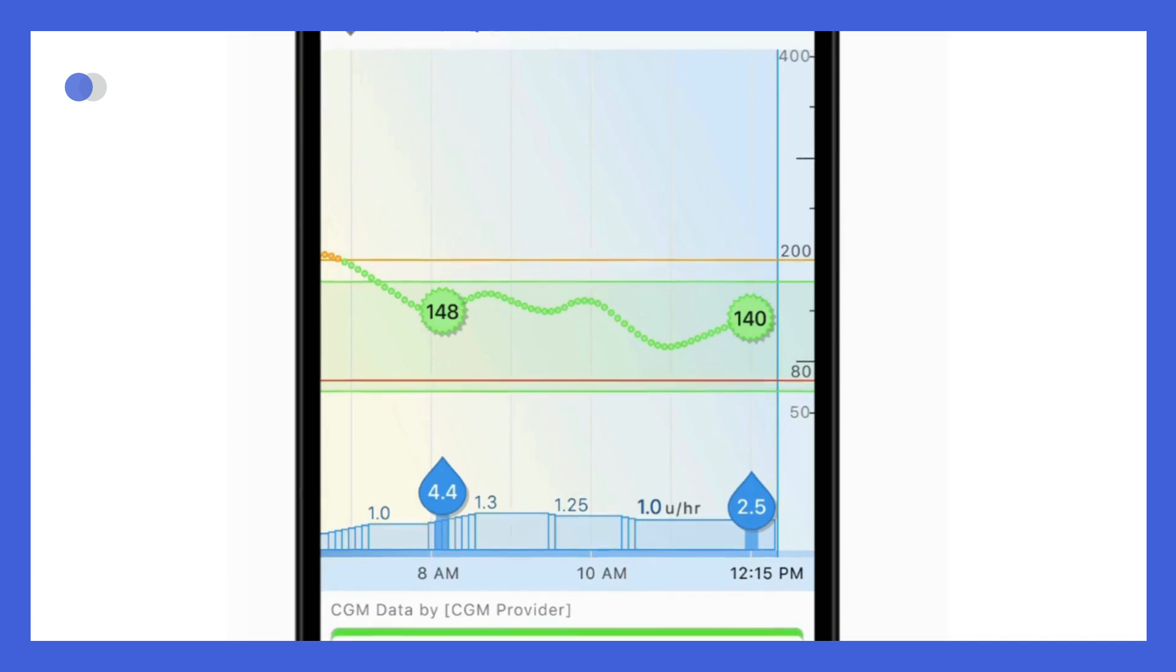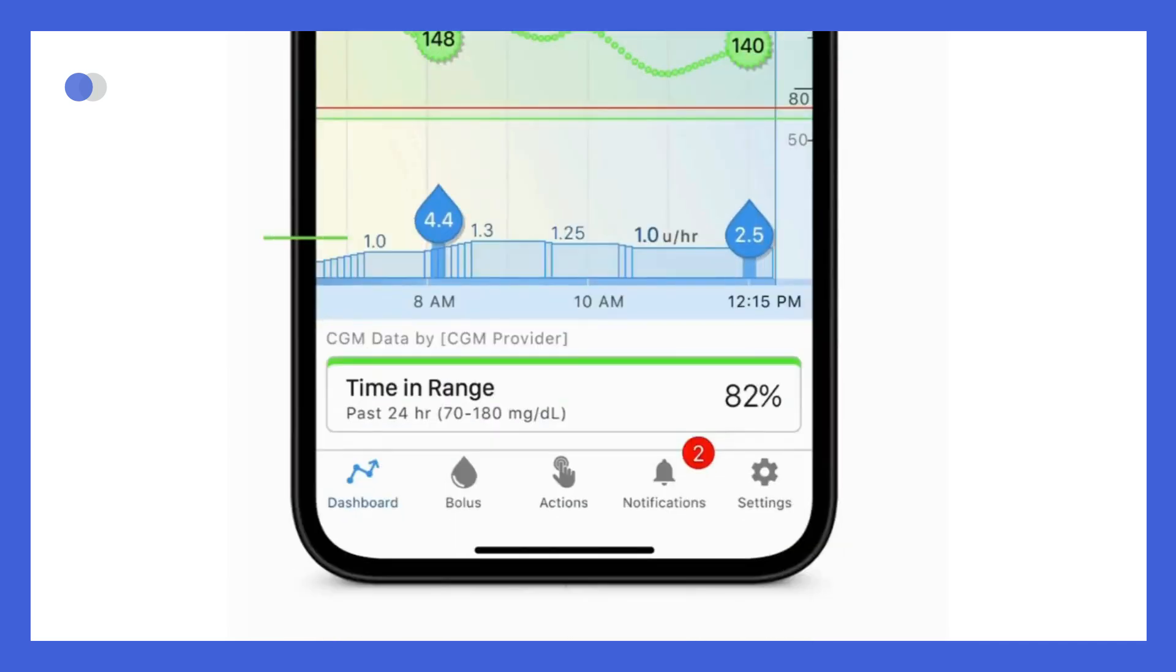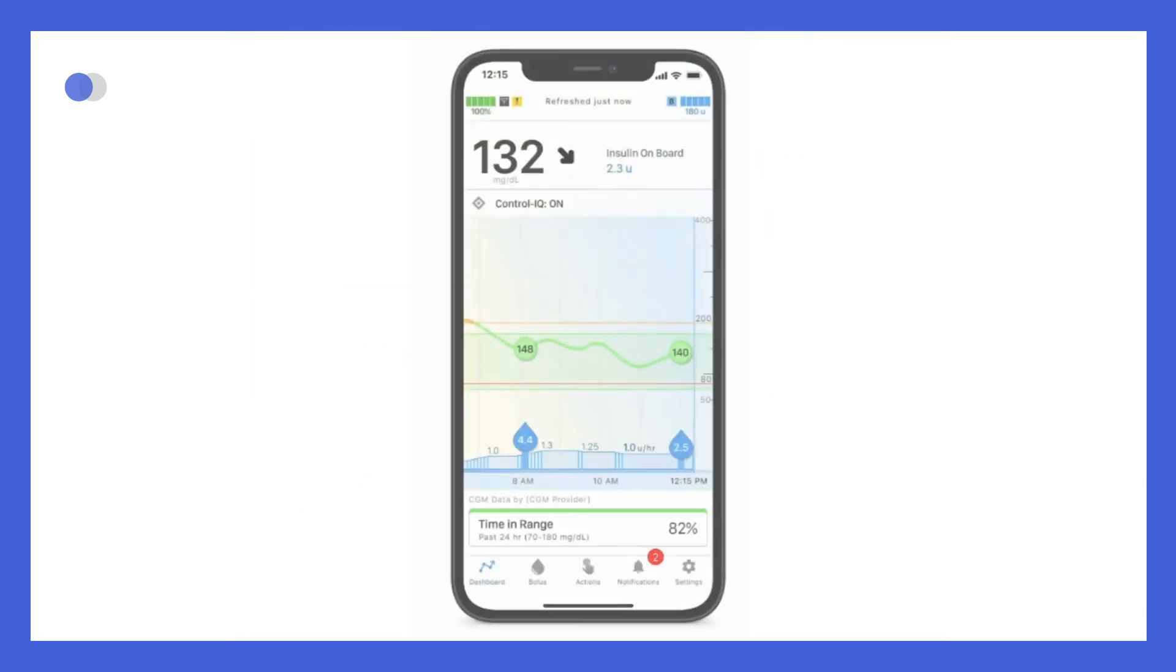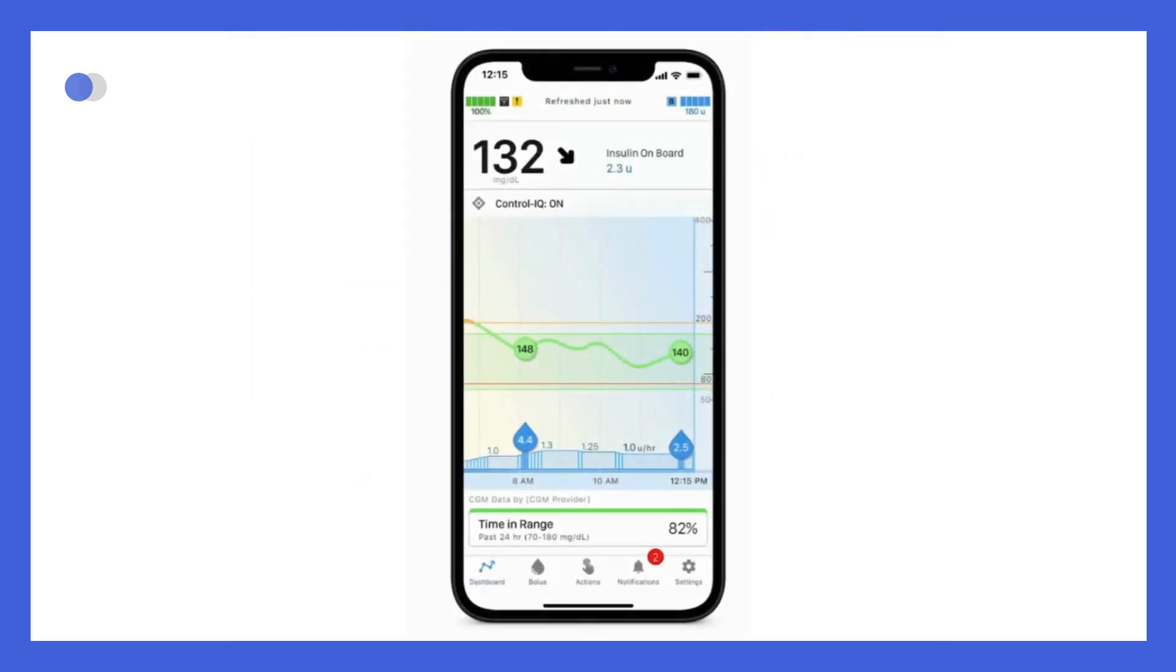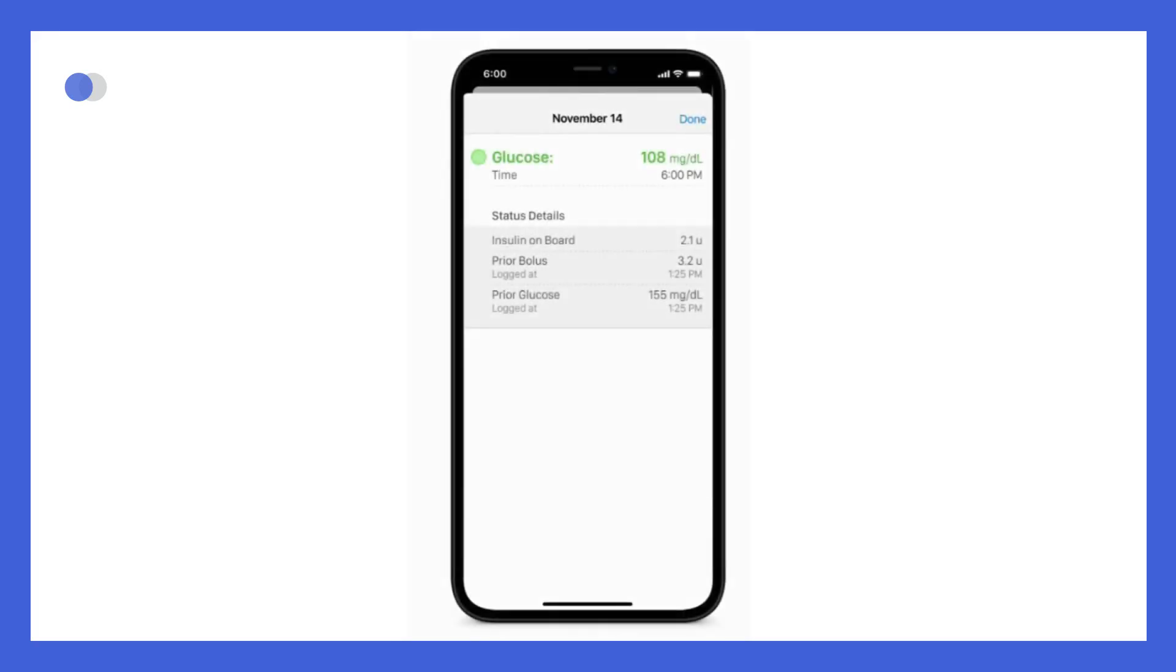At the bottom of the dashboard, you see the basal rates for the past 24 hours, including changes in insulin delivery related to use of Control IQ technology. The amount of insulin delivered as a bolus is shown as a droplet. This includes meal boluses, manual correction boluses, and any automatic correction boluses within the time frame displayed on the dashboard. If you tap on a bolus icon or a glucose value on the graph, detailed information about that event will pop up on the screen. Right beneath the graph, you see your time in range for the past 24 hours. This is calculated based upon the values you entered into the target glucose limits found in glucose threshold settings.